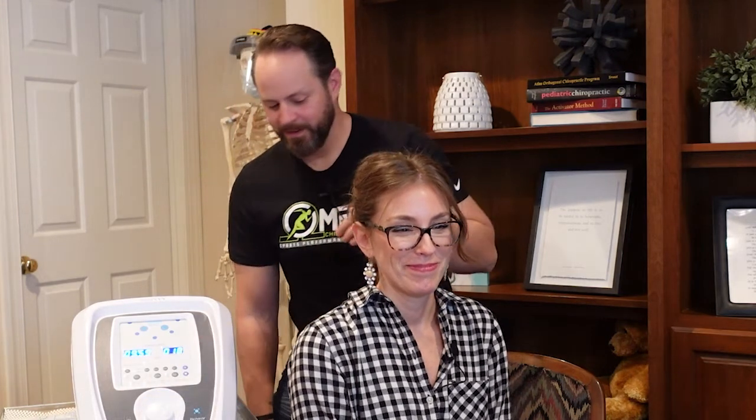Push play. And then, so we had it on a setting for an interferential. This one is really trying to help drive some healing and anti-inflammatory processes in this area. So this setting is going to cause it to contract and then relax.